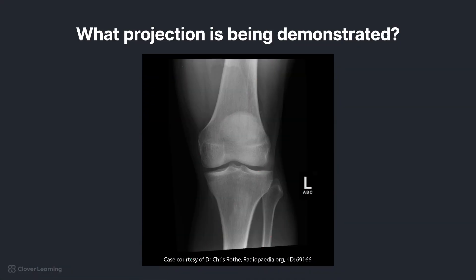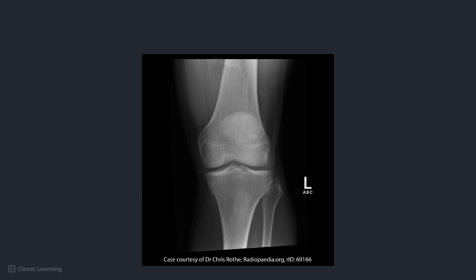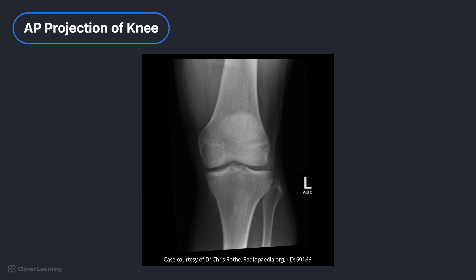Take a look at this radiograph. What projection is being demonstrated? How do you know? Let's find out the answers to these questions. If you said this radiograph is an AP projection of the knee, you're correct.